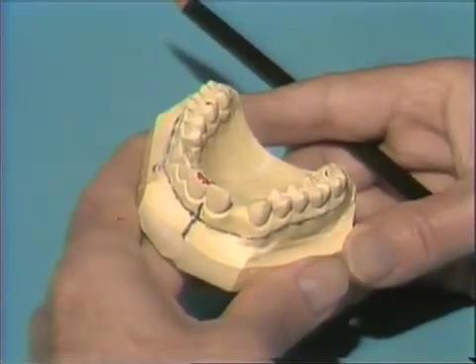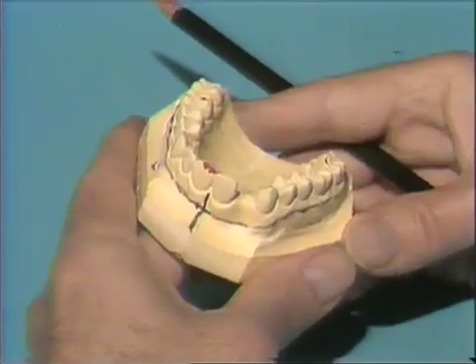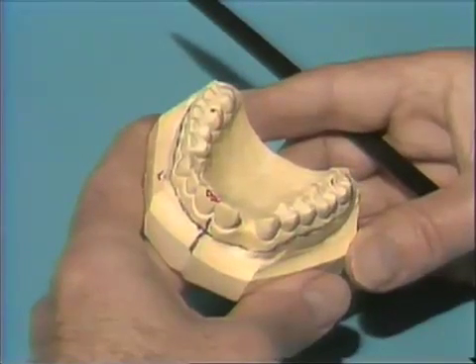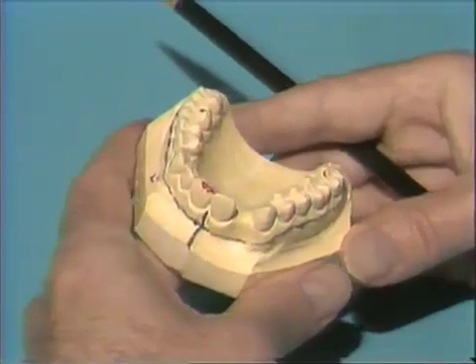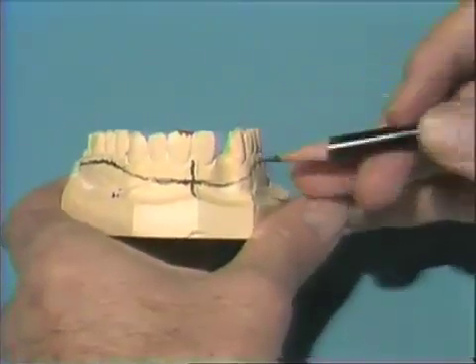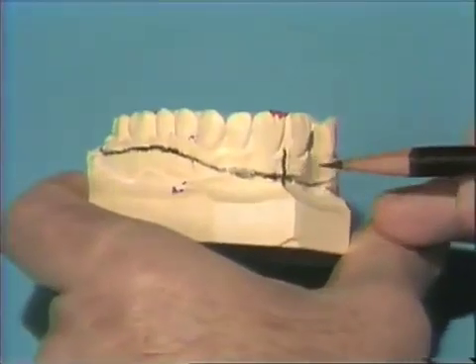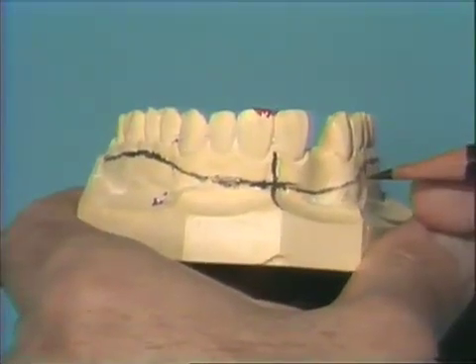Different impression materials require different designs of trays, as do the different procedures we are doing. With vinyl polysiloxane materials, we would like to have a customized tray so that we can maintain a uniform thickness of the material, which contributes greatly to the accuracy of the impression. Here we're making a tray for an anterior bridge, so we would like to capture the soft tissue in the area of the bridge, and also a good portion of the dentition on the opposite side, so that we can give this to our technician and he can develop something quite aesthetic.